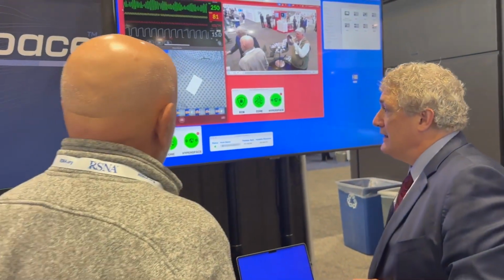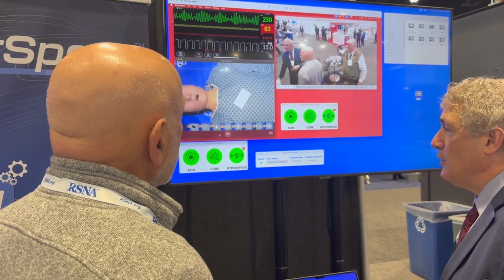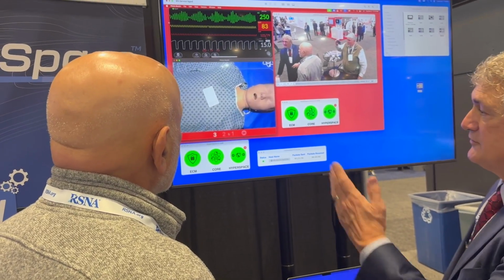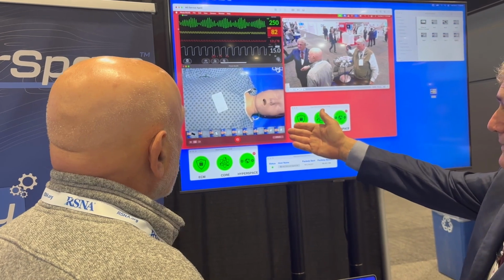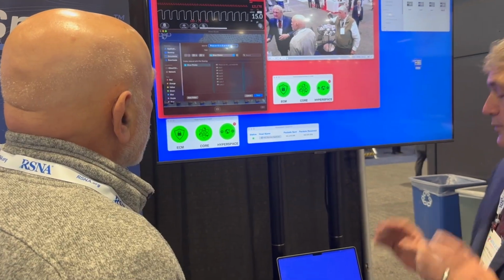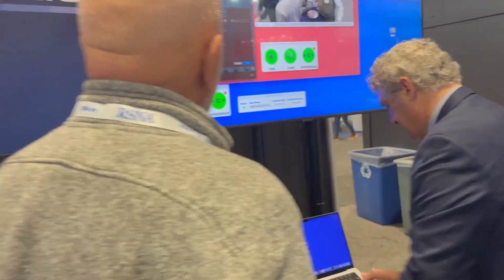All right, you see that that's a live image. I'm gonna now come over here and take a picture. I'm operating the equipment. I come to here. See, this is the image. I click it, it does 3, 2, 1. Takes the image of the patient. The image shows up. I can now export that image. And when I export this image, it's actually exporting it. I'll call it Tuesday 3, since it's Tuesday. It's early in our show.